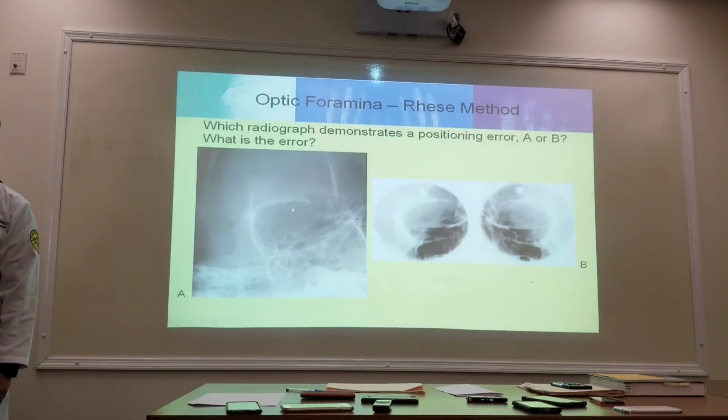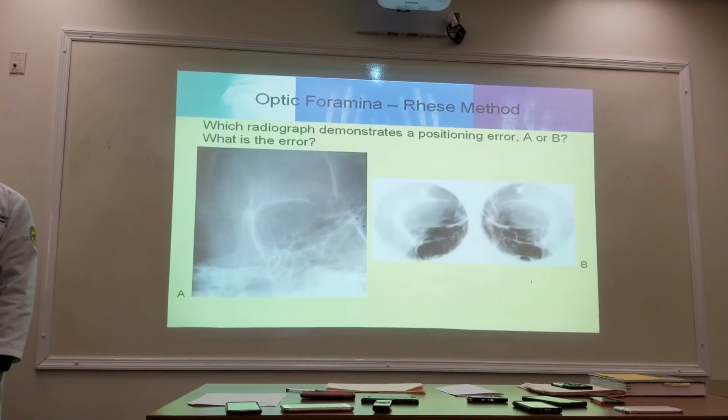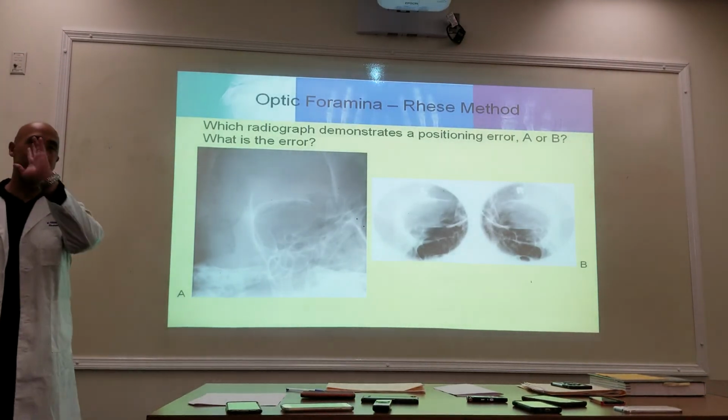Where's that located? If I cut this into fours, it's not really in the quadrant. It's kind of in between two quadrants, right? So it's underrotated. It's underrotated, yeah. So they didn't get that 37 degrees.